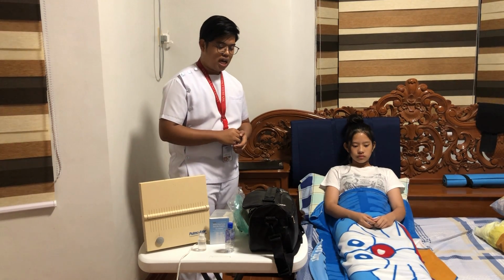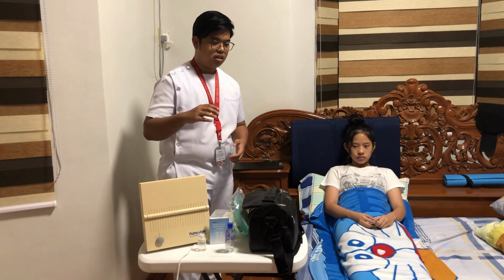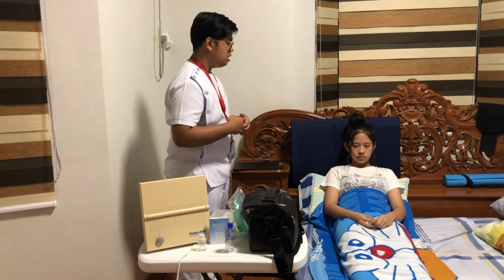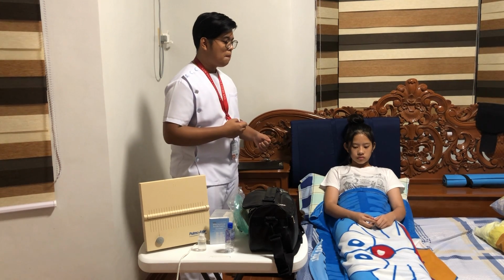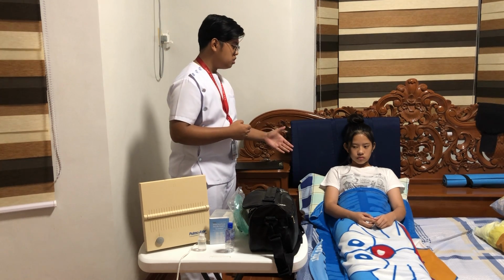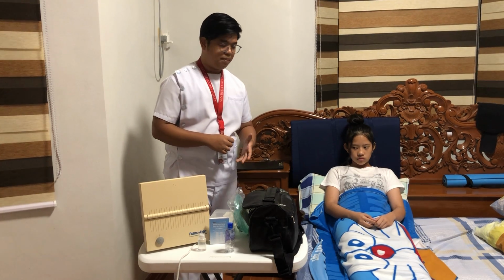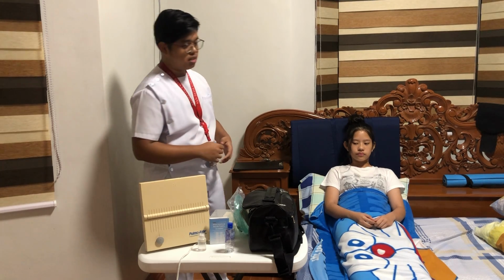So ma'am, today I will be performing or giving you the process of nebulization, so that you will have an easier airway. It will assist you in your breathing, so that it will resolve your issues, including the difficulty in breathing. And of course, we're going to administer a medication which is Duavent, that will help you in the breathing process.